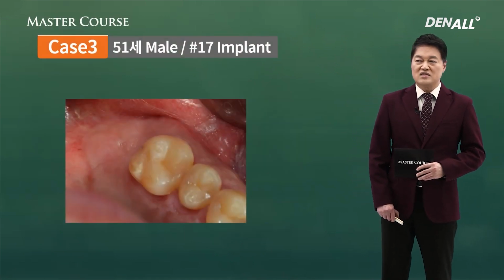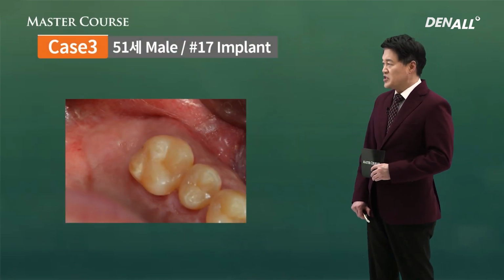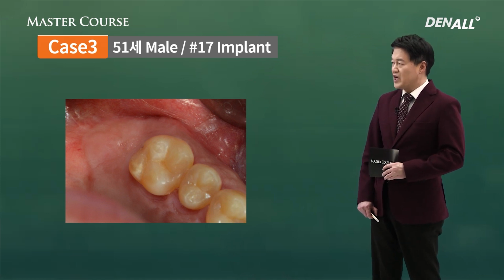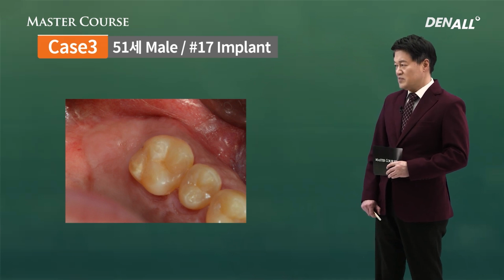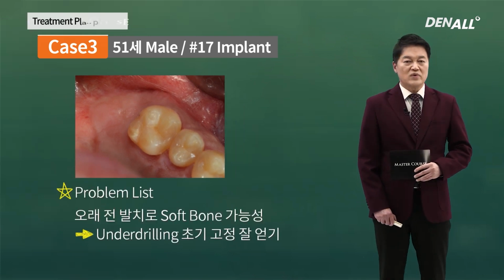Let's look at the third case. A 51 year old male patient, number 17 was missing and an implant was to be placed. Let's look at the problem list.